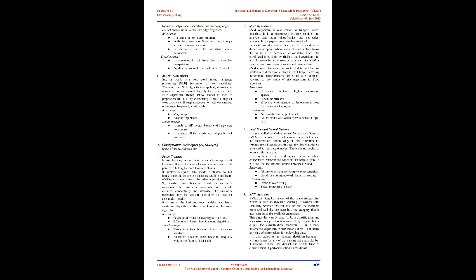Another important property is that it is computationally simple, which makes it possible to analyze images in challenging real time. Advantage: computational simplicity, good performance, high differentiating power. Disadvantage: less speed because of long histogram. It misses out the structure because it does not consider the effect of the center pixel. Noise sensitivity is high.